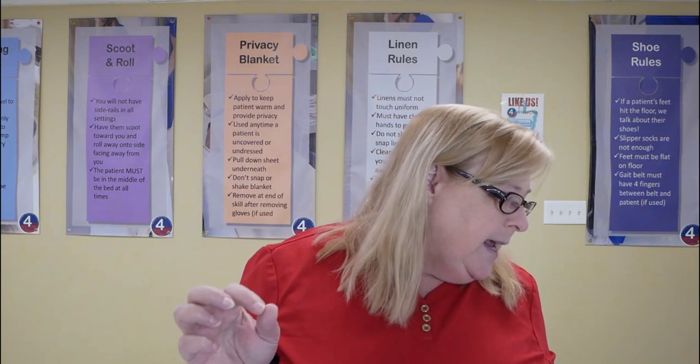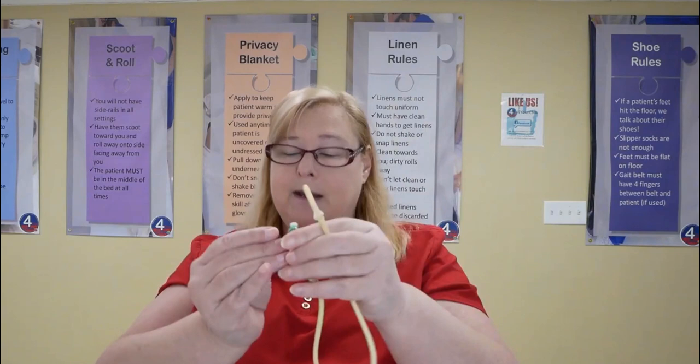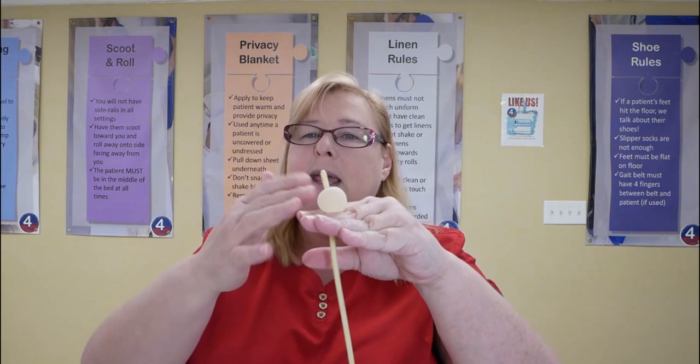So you can have different types of bags based on what the patient needs. There are also different types of catheters. So on that same page, on page 116, what we've talked about so far are Foley catheters, or what's called indwelling urinary catheters. We put the catheter in, we inflate the balloon, and that keeps it there indefinitely, as long as we need it, or up to 30 days, and then it would have to be changed out. This is called an indwelling or Foley catheter.